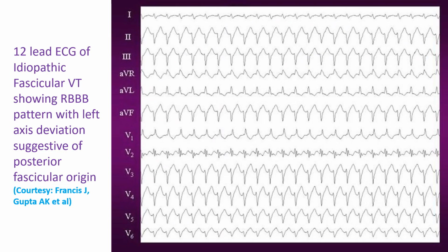Fascicular VT is one type, the site of origin of which is familiar to most of us. The original description dates back to Belhassen et al. in 1981. Left posterior fascicular VT has a right bundle branch block pattern with left superior axis and RS complexes in V5, V6. Scar VT after inferior wall myocardial infarction can resemble fascicular VT, though the QRS will be wider.